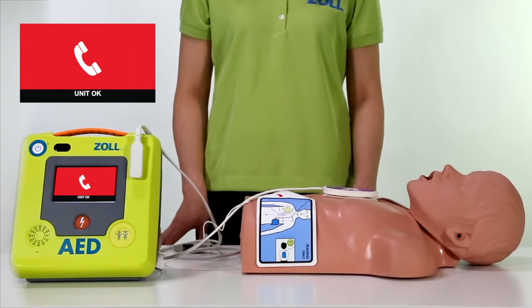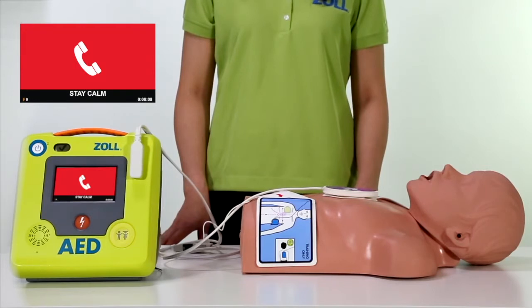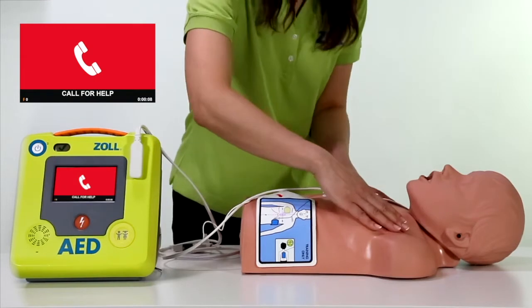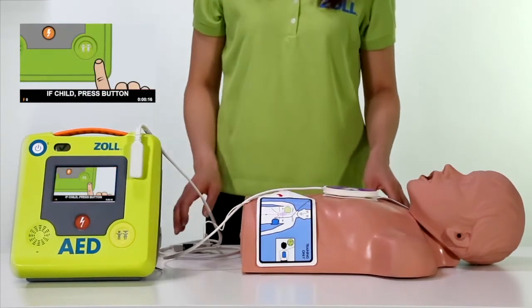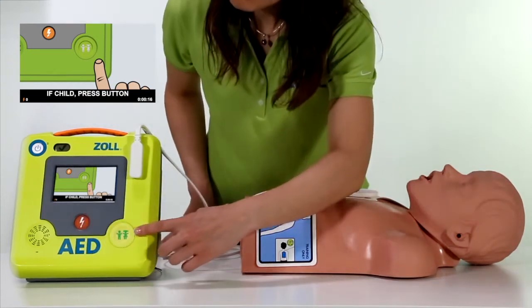Unit OK. Stay calm. Check responsiveness. Call for help. If the patient is a child, press the child button to quickly change to a child rescue if needed.